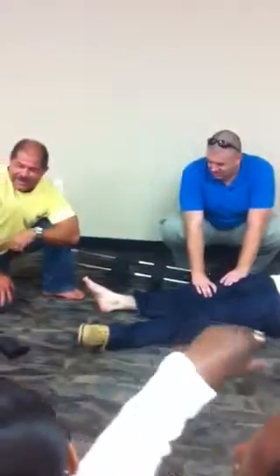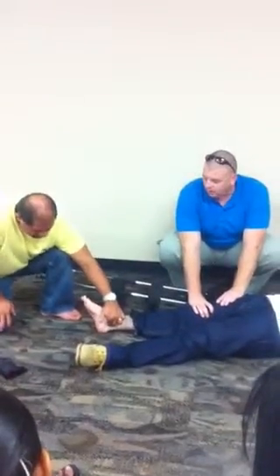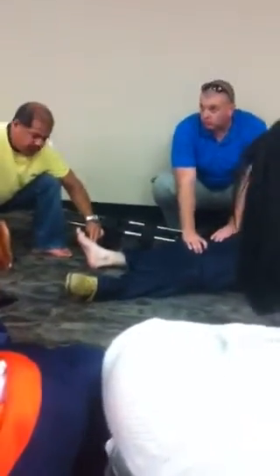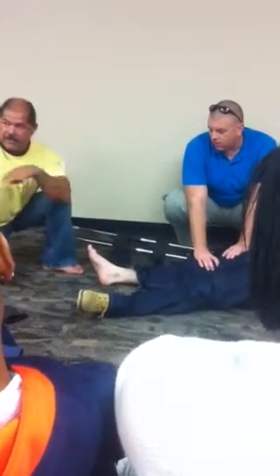Okay. Now what you want to do is check pulse. Now where do you check for pulses? Right here. And by the way, when you do this, if you'd like to wear gloves, you're welcome to. But I really want you to try and find those pulses. Because if you ever really need to find one, and the ER doc says, go find me a pulse on top of this foot, and you're going, okay. And he's going to call you a DA, okay? And that doesn't mean district attorney, okay?